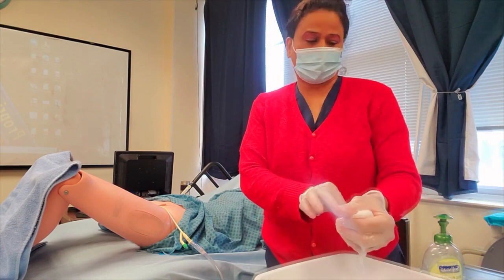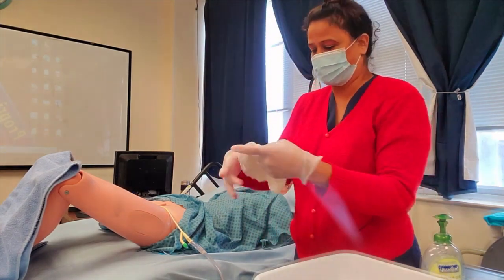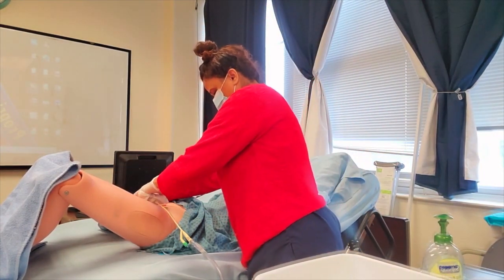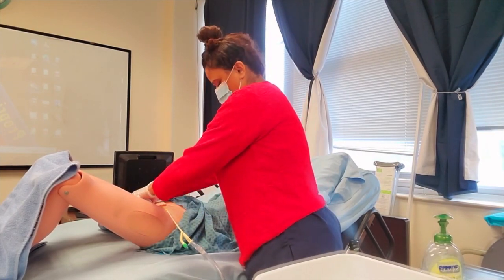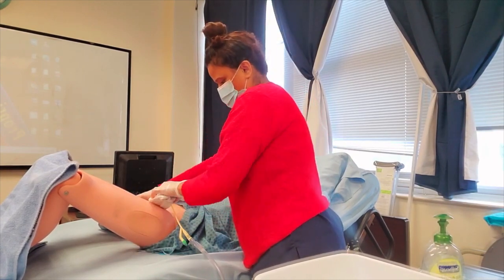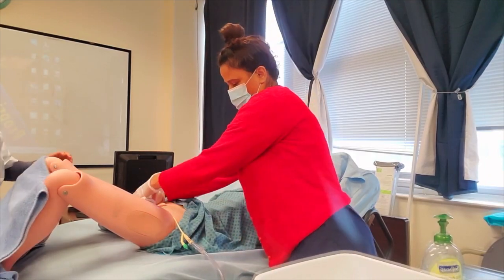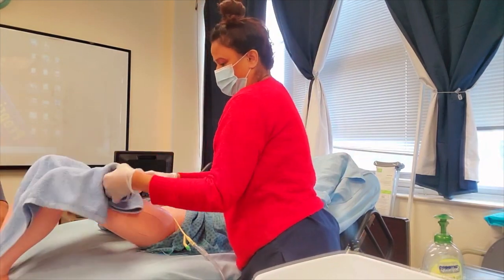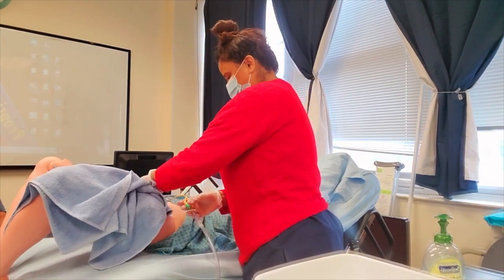That was the soapy water step. Now we're going to rinse. We have rinsing water here and we also have a drying towel to dry it. This is all rinsing water. Use the four corners to rinse: one, two, three, and four. Then get your drying towel and pat it dry.